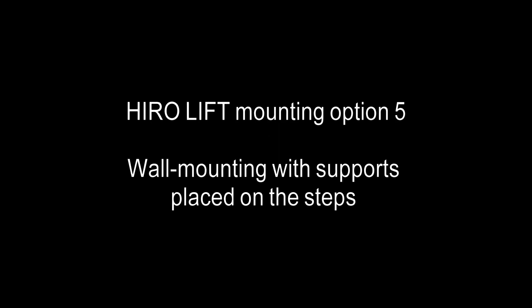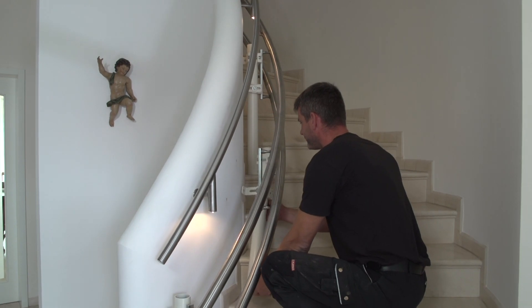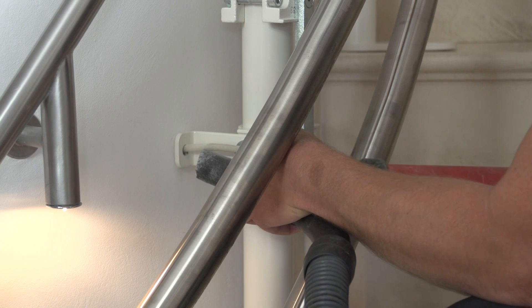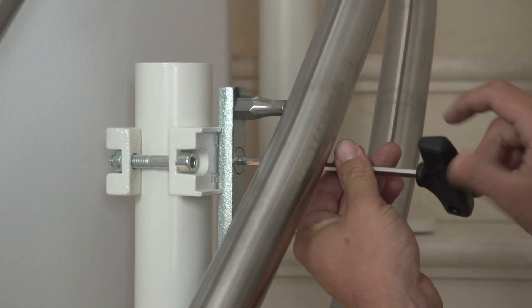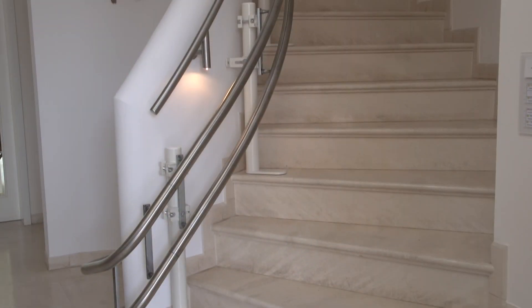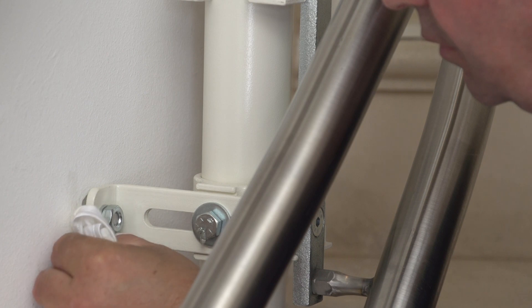Hero Lift mounting option five: wall mounting with supports placed on the steps. A special type of wall mounting also involves simply placing the guide rail supports on the steps to absorb the weight. The supports are then bolted to the wall at the side using a bracket.